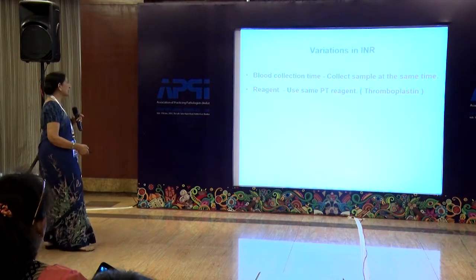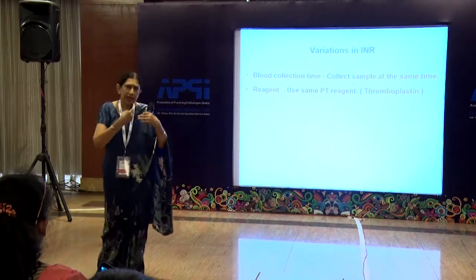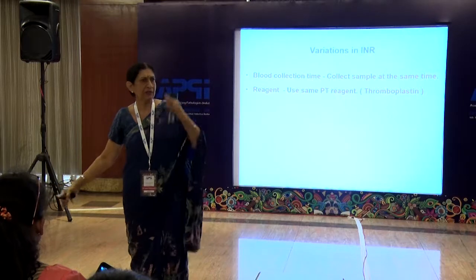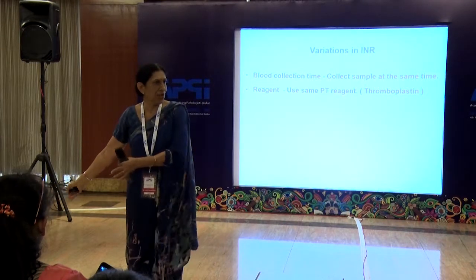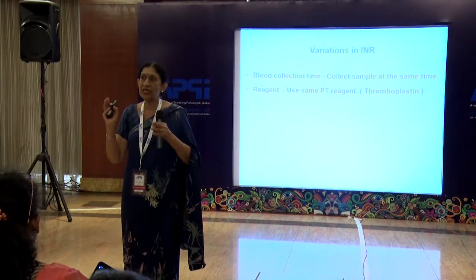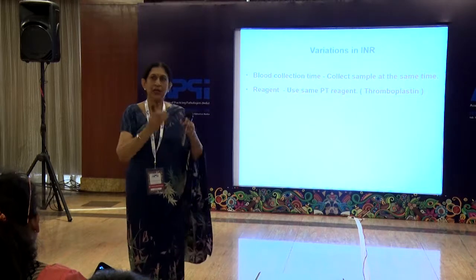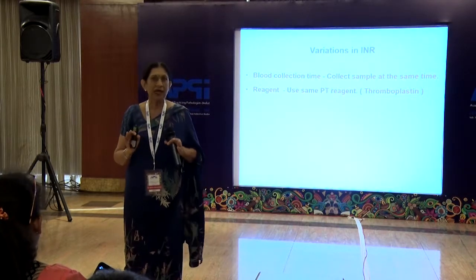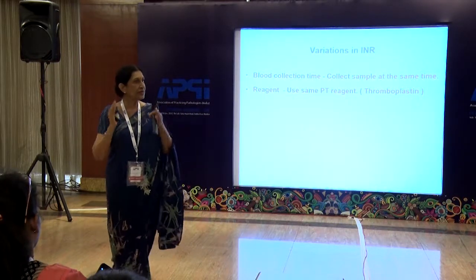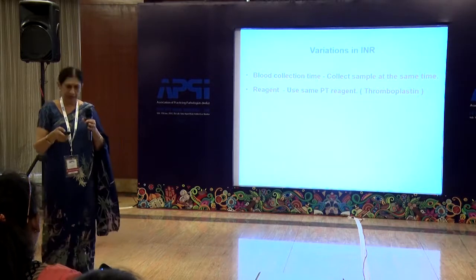Blood collection, collect the sample at the same time. [Hindi: Today he came to me, he just took the tablet. He went to that lab, took the tablet in the morning 4 hours before, and now the test is being done for me in the evening. Wrong.] You must impress upon your patients that please come to me, take your tablet at the same time, come to me at the same time, and if you can't come that day, don't come that day. But come at the same time following the dose because you will never get the correct value.